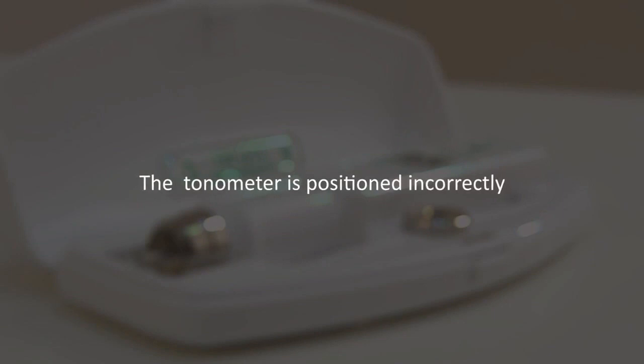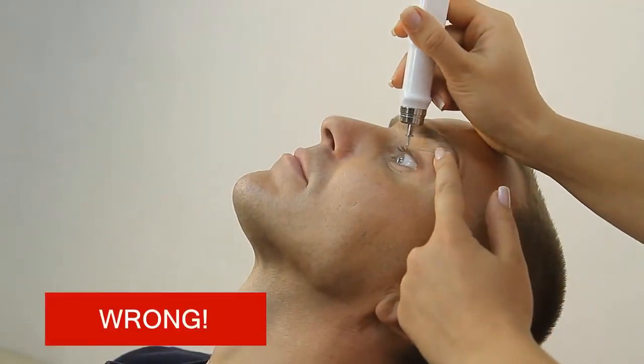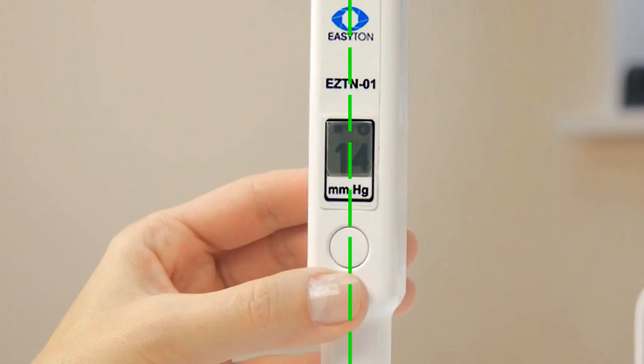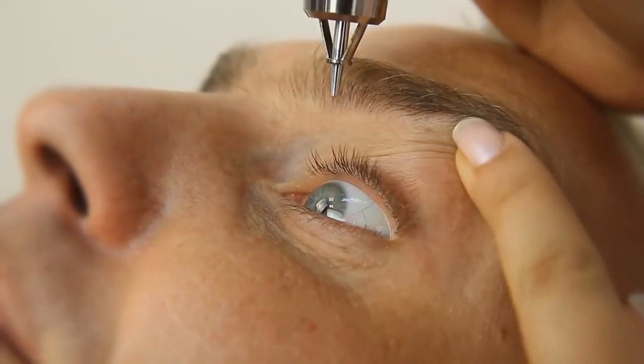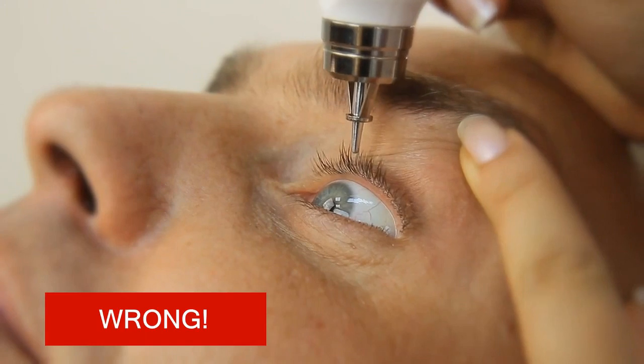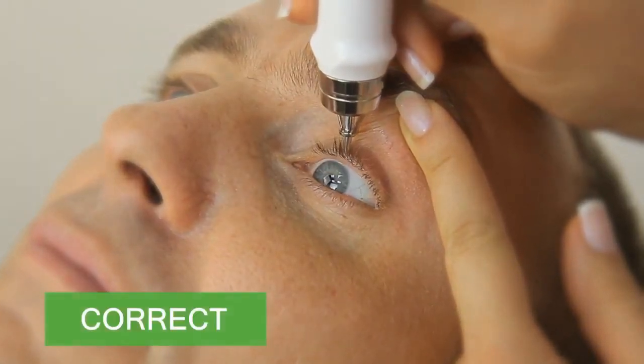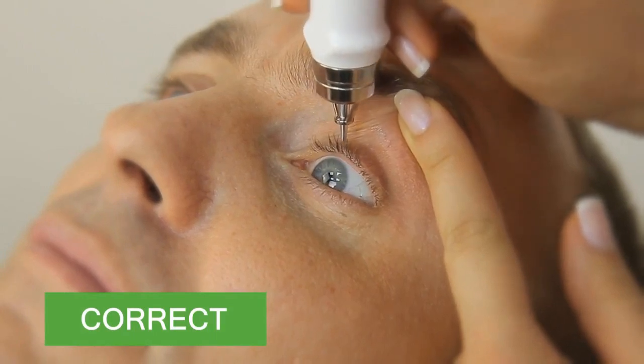The tonometer is positioned incorrectly — the tonometer body deviates from vertical position. The measuring is only done when the tonometer is placed upright. The tonometer is lowered too far down and the protective ring touches the eyelid. The protective ring should not touch the eyelid during measurement, but be placed 2 to 3 mm above the eyelid surface.